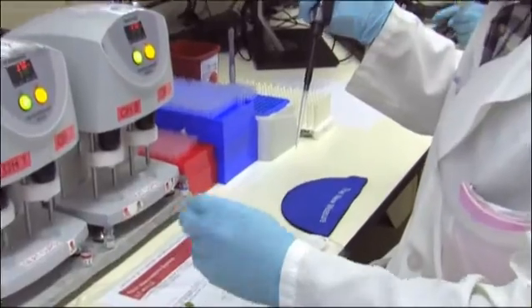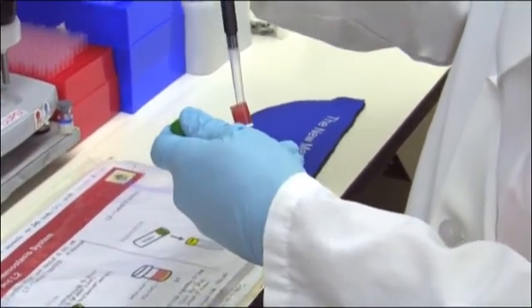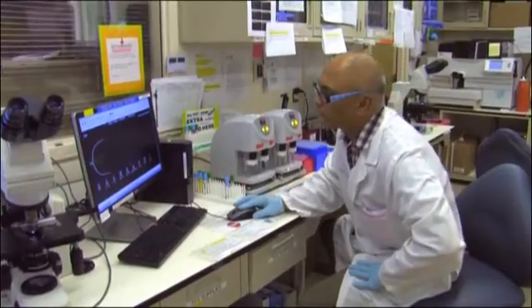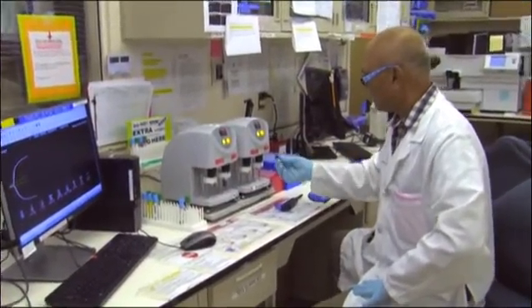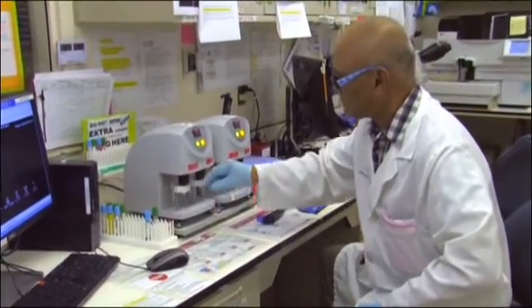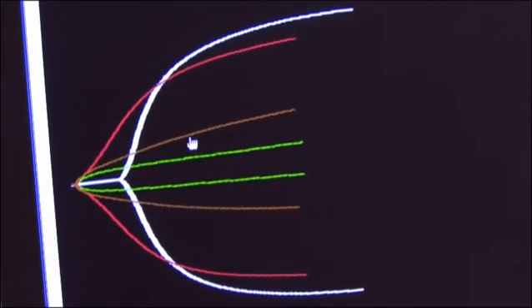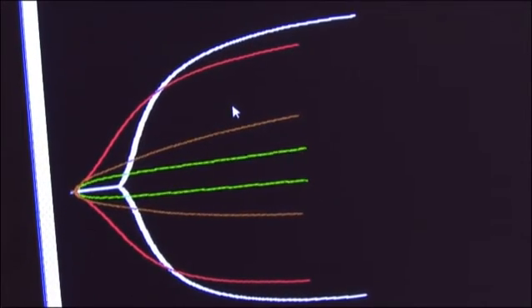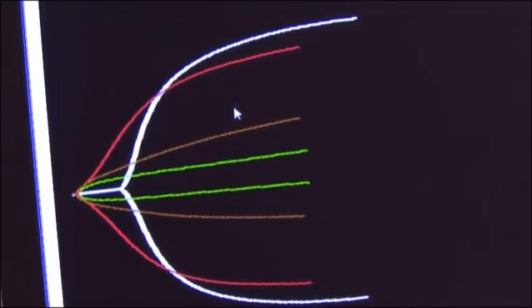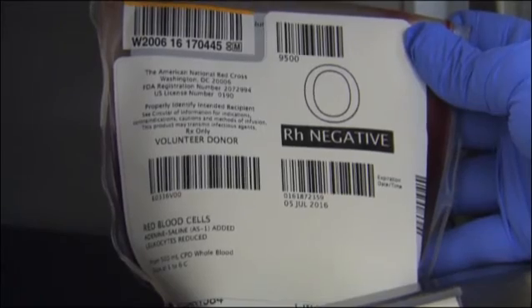And what we do is we test the patient's sample against the blood to make sure they're compatible. Now that's important with surgeries. We play a big role with code hemorrhages and red trauma tier 1. We are South Orange County's only trauma center, so it's important for us to provide that blood in a timely manner.